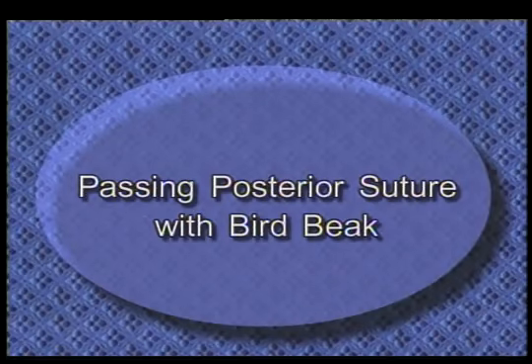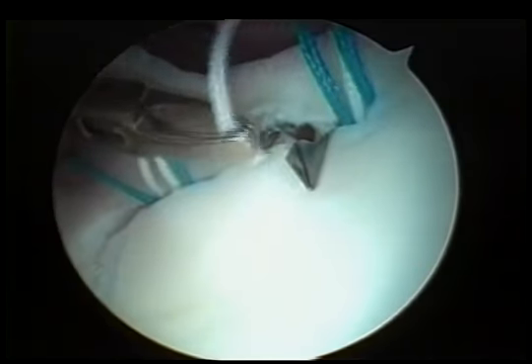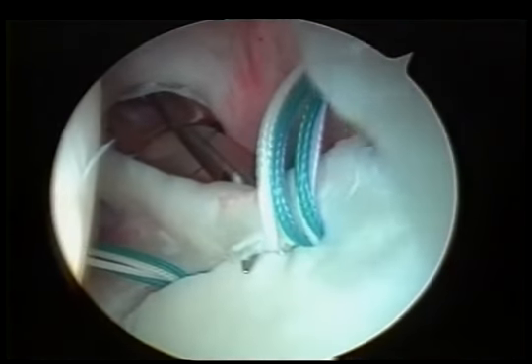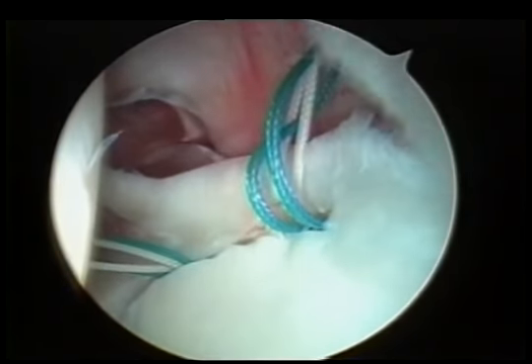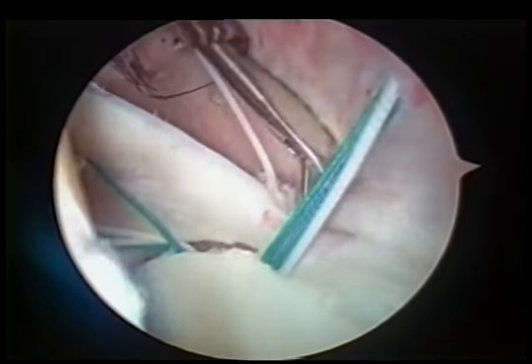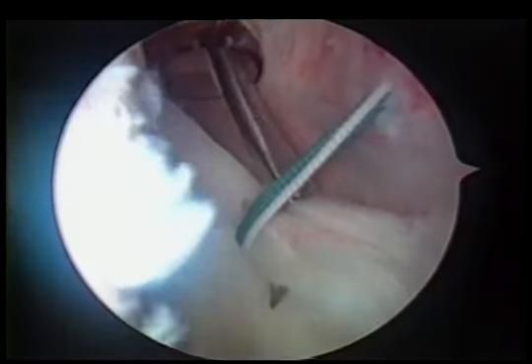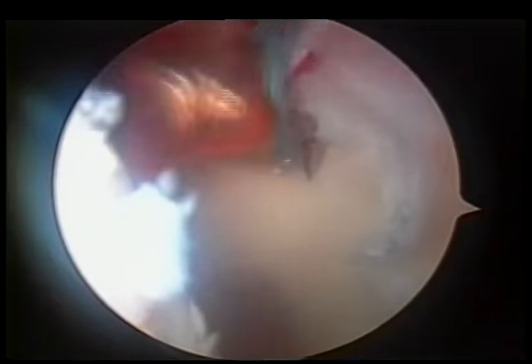I like to pass the posterior sutures first. We use the 45-degree bird beak suture passer, and we're going to do a handoff once we've passed this through. We'll pass through the labrum just at the margin of the articular cartilage. We have two sutures per anchor. These are color-coded, and we'll try to have about a centimeter separation between the two. You see how the 45-degree angle of the bird beak is just about the perfect angle for passing these sutures from the posterior anchor.